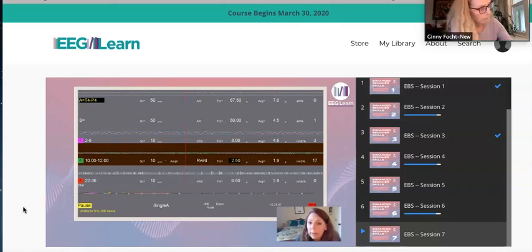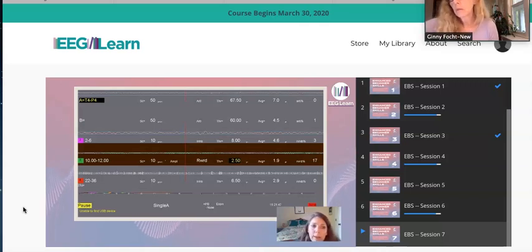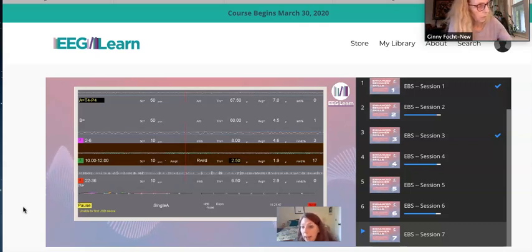You can trust that people's brains are inherently motivated, given the choice; everybody's brain will prefer to make alpha at P4 versus T4. So here again, everything probably has room to come up as long as the difference in what we're rewarding is coming up. Eventually, we would hope that the difference in the alpha reward would be greater than the difference in the slow wave. That's going to take a while, and some people might not ever get there.